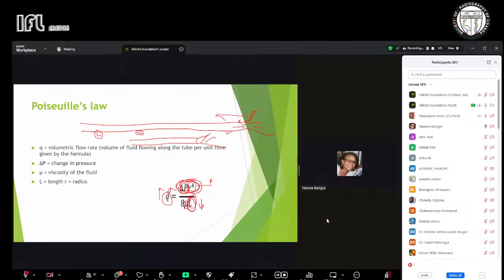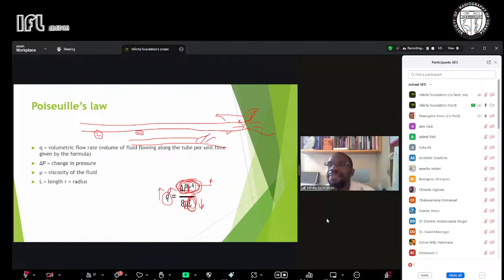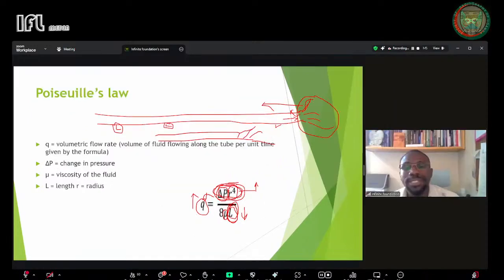Yes, if there is a problem here, we are going to get resistance throughout, but the variation will be less. His question was why we get a difference between the two, and the difference is from hemodynamics. We shall have high resistance there in case of a problem, but it will not be equal because of distance. Thank you.